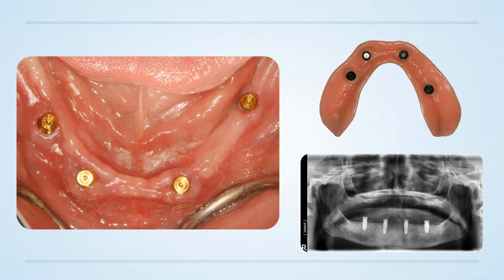And if you feel comfortable doing this, you know that you've got enough bone above your inferior alveolar nerve, which a lot of patients that are soon to be edentulous do. For our patients that have been missing teeth for 30 years, you're probably not going to have bone back here past the foramen. But for my patients that are extraction cases, if I can socket a couple of implants, like in the mesial root here of 30 or 29, the mesial or distal root of 18 or 19, and then the canines, or maybe even the laterals, you get a phenomenal result.